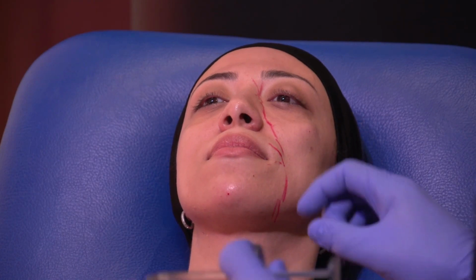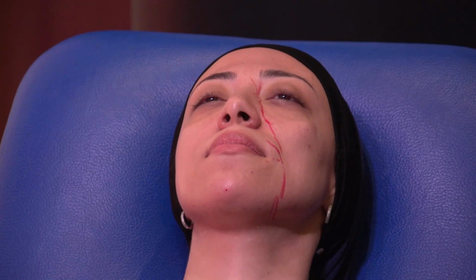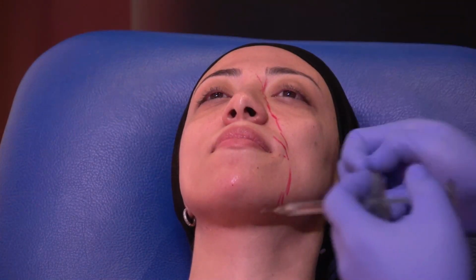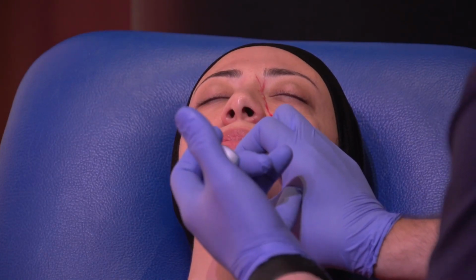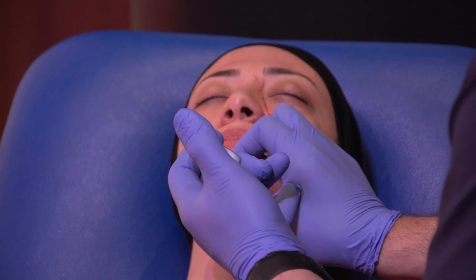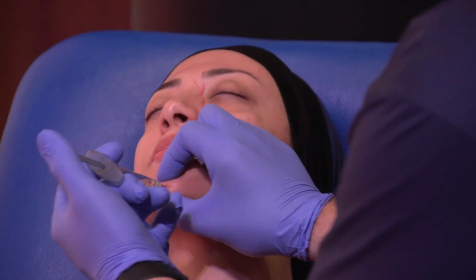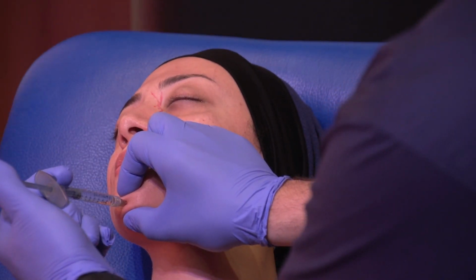Okay, so again, I've sterilized this area. Give me an alcohol swab again. See? Obsessive compulsive. Sterilize the area. Same puncture hole. Try to get the same puncture hole all the way down to the bone. Same technique. Most of the bolus on the needle. Sorry, let's turn a little bit. Okay. Whole bolus in the midline.